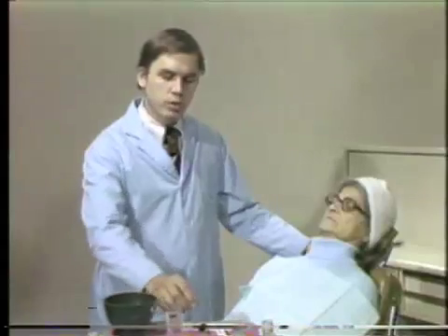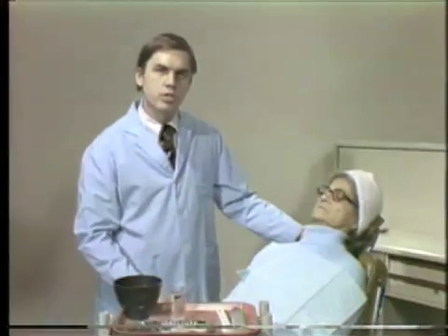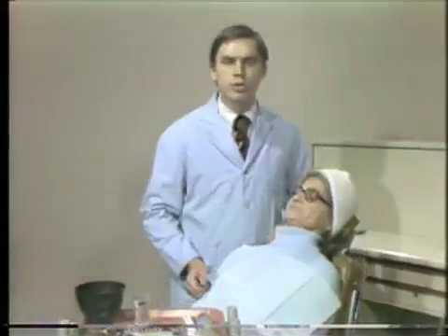The result we would like to obtain is an alginate impression that shows the maxillary residual ridge and the buccal and labial vestibules to their full extent. This will be used in the fabrication of a preliminary cast.